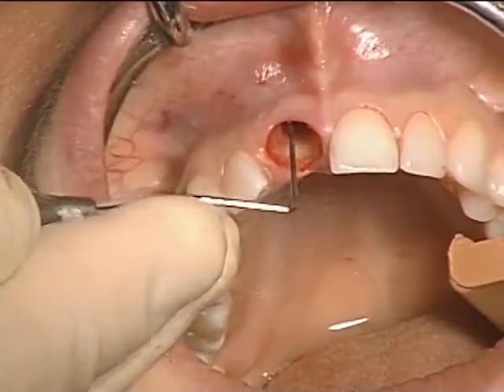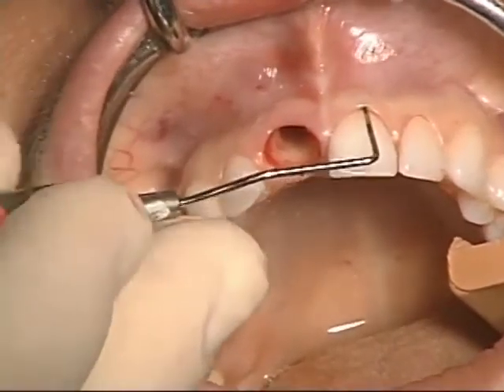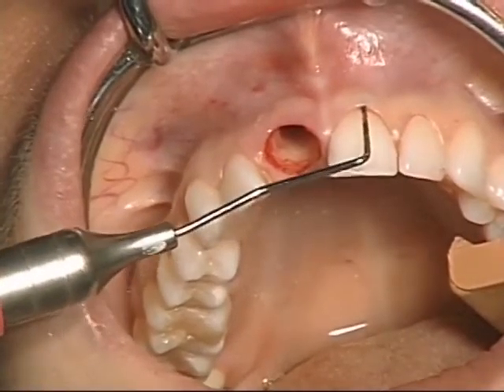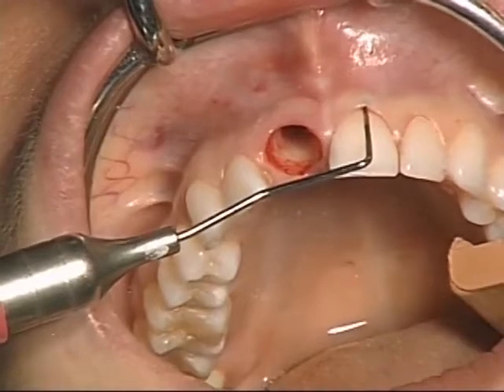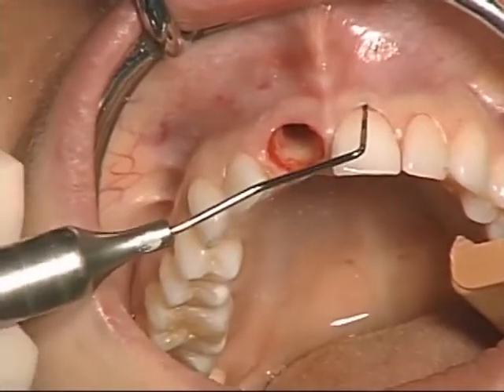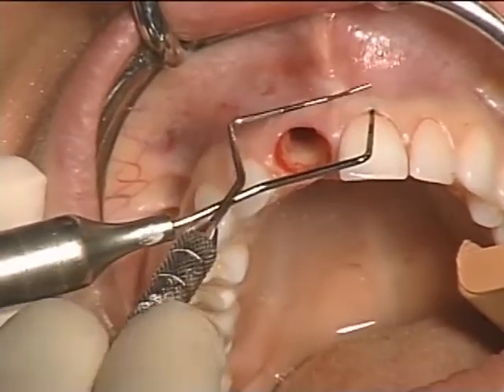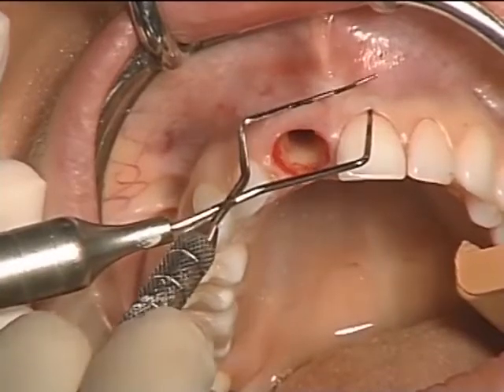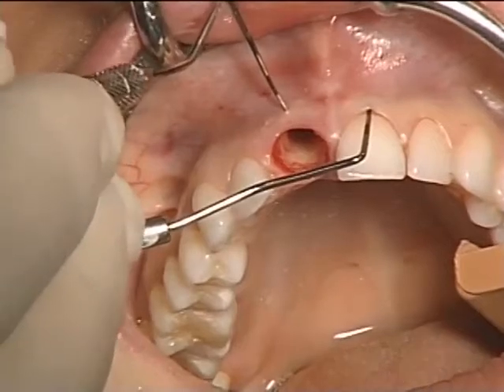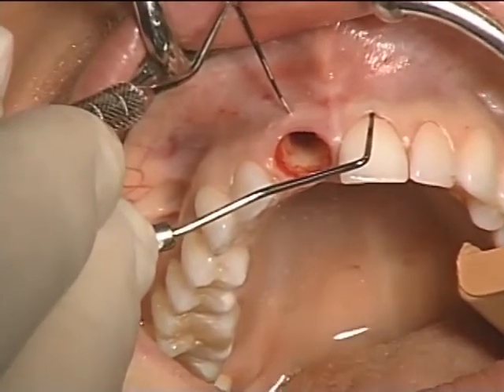This is very important because as we start to discuss the depth of the collar placement, we are going to follow the line drawn from the facial height of contour of the natural contralateral tooth we're replacing. That will be the position where we place the top of our implant collar, or slightly below that crest of bone, depending on variables of tissue biotype, emergence profile requirements, and also the contour of the buccal plate. So as we've evaluated the depth of tissue height contours, we now know our depth of placement. We have cored our site.